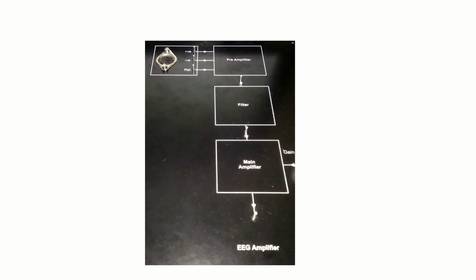Now if we look into the processing blocks present in this simulator, the probe from the scalp electrodes will be connected to this particular block.